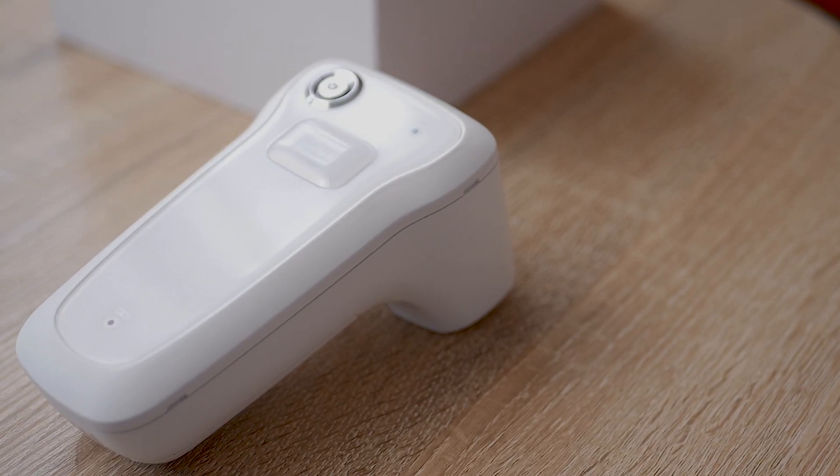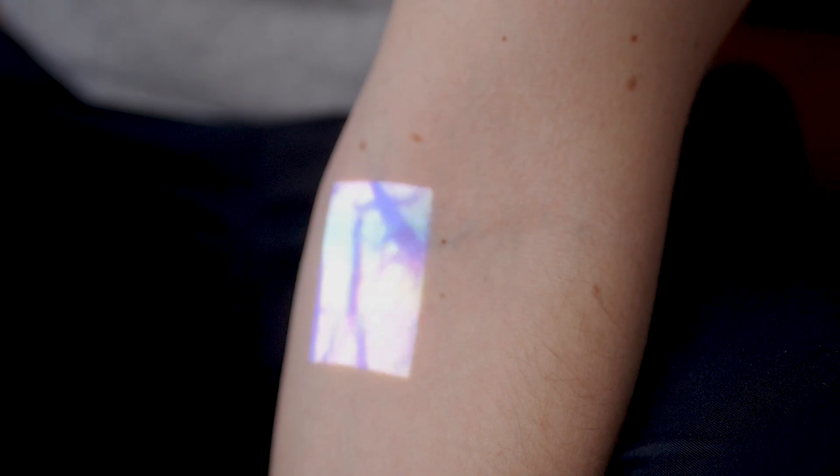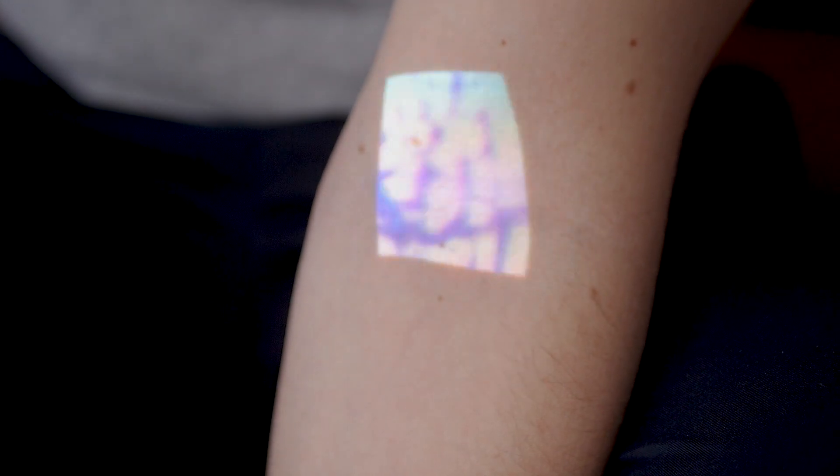And this way, the company says, this device is not replacing nurses and phlebotomists, but it can contribute to those professionals making even better decisions when it comes to finding the right vein. For some people, like myself, it has been an easy task for nurses around me, but in some cases with some patients it's a really complicated task. So any technology that is still affordable and can contribute to the process would be a great addition to the range of medical technologies we have been using already.